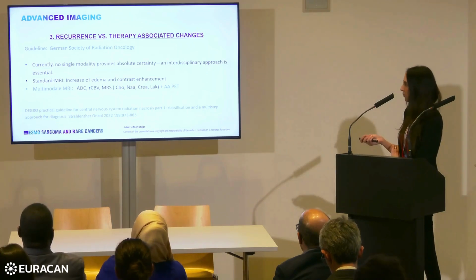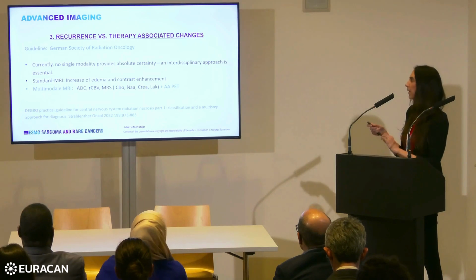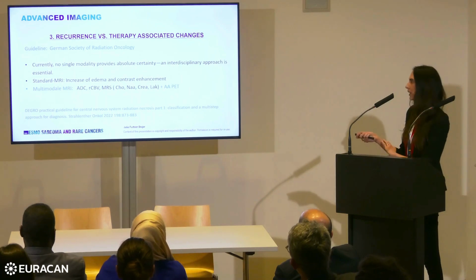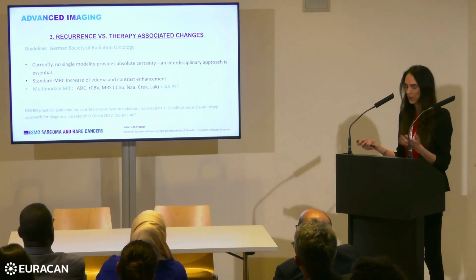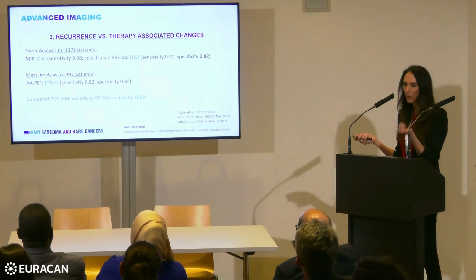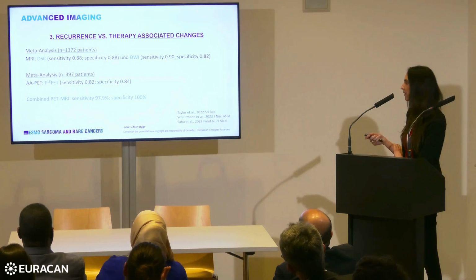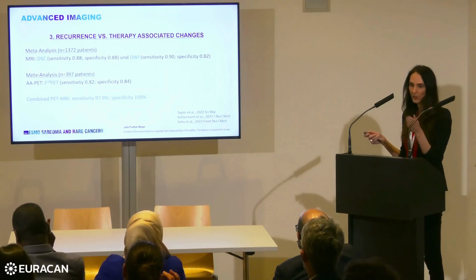On the standard MRI, we see increase of edema and contrast enhancement in both recurrent tumor and therapy-associated changes, and only the multimodal MRI sequences such as diffusion-weighted, perfusion, MR spectroscopy, and, if available, amino acid PET can give you more information. This is also underlined by these studies. You can see that perfusion, diffusion, and also the amino acid PET alone show a very high sensitivity and specificity. However, the combination of PET and MRI outperforms each single technique.